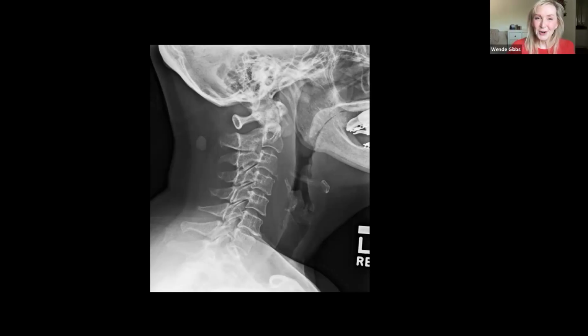So this is to start the imaging evaluation with X-ray. When you hear of somebody with chronic neck pain, you think you're looking first for degenerative changes. And so on X-ray, when we're looking at the bones primarily, are we looking for end-plate osteophytes, loss of disc space height, listheses? But when we hear acute on chronic, we know something has changed, especially if it's severe. So in that situation, we're also looking for, because that's the topic of this session, infection or something like cancer or something else, especially if she hasn't had any trauma.